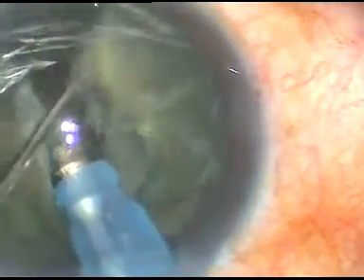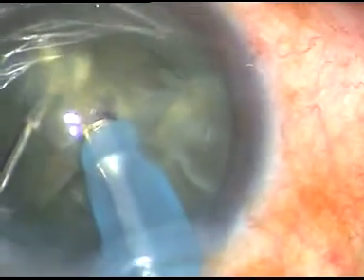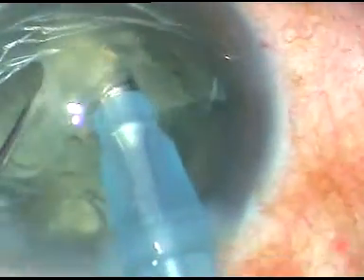This is vertical chop. It has been chopped very nicely. The nucleus appears brittle and it is being chopped very nicely. That's it. Now this is the other heminucleus. It is chopped. So I have divided the nucleus into 4 fragments.